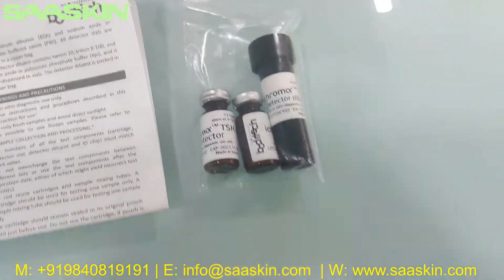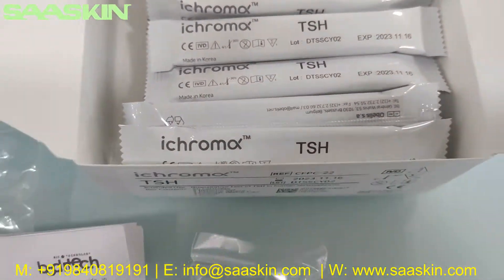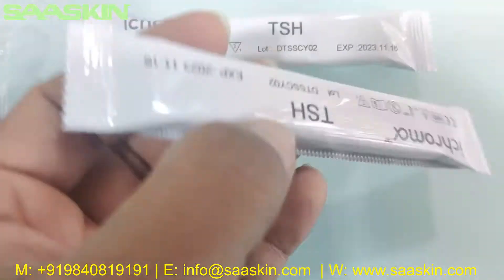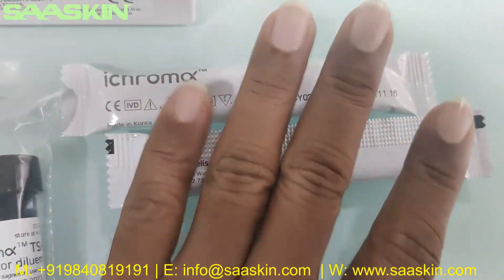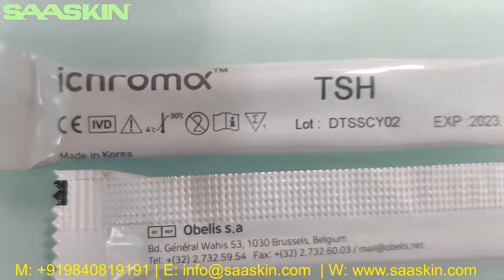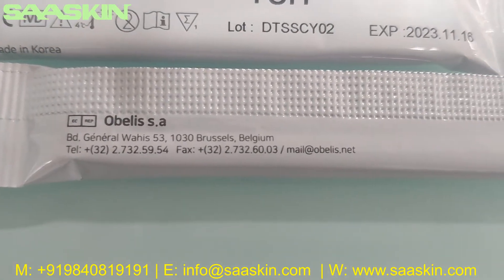Inside the sealed pack, you can see 25 test cartridges. This is the test cartridge of the iChroma TSH — CE-IVD certified. You can see the lot number and the expiry date on the cartridge pack.